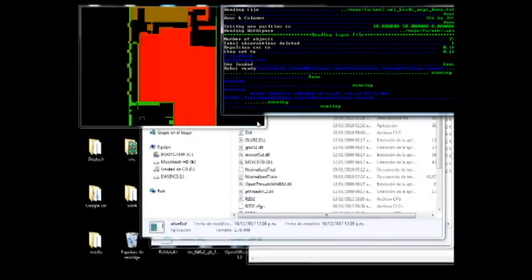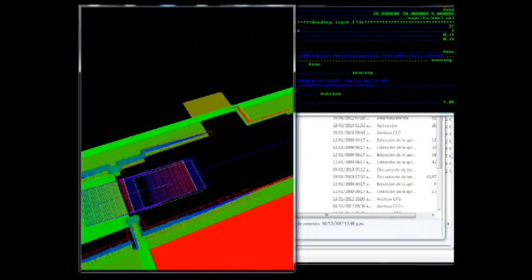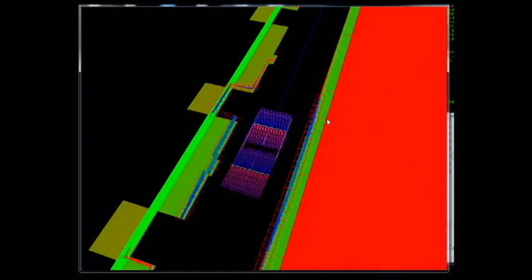Like here we choose a destination, then a path is calculated, and then begins the process of fine-tuning some parameters before using the real model or the real robot, in this case the autonomous wheelchair. As you can see here, there's a simulation with the same tool we use in real time to control the chair. You can see how it's adjusting its motions according to the desired path and the potential fields.